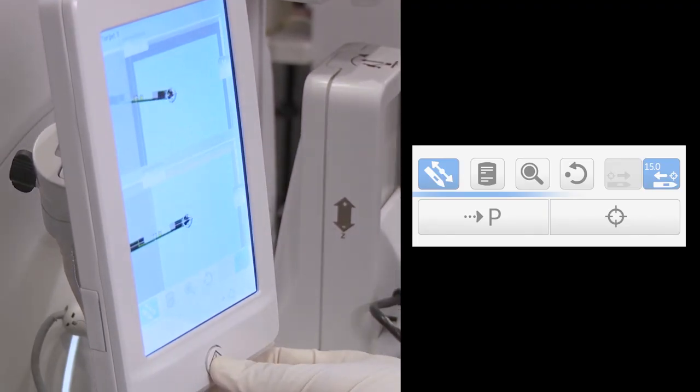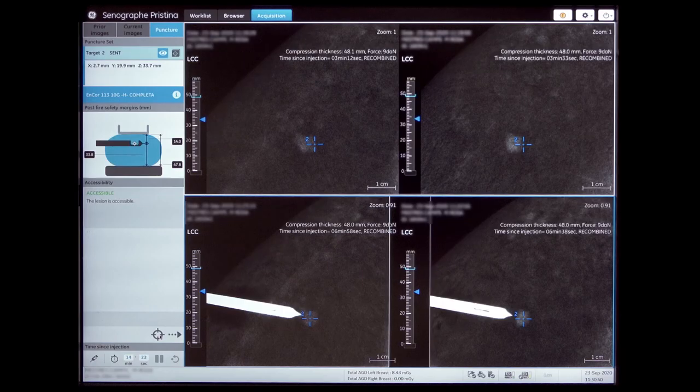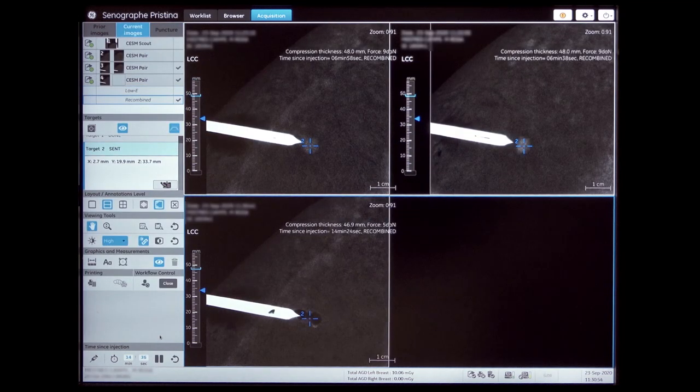Use the needle preset button to move the needle tip back by 15 millimeters or more. This will allow the marker to be displayed without being hidden by the tip of the needle on the following stereo pair. Tissue marker deployment can be verified with a stereo pair, single or dual energy, or with a DBT acquisition, preferred.